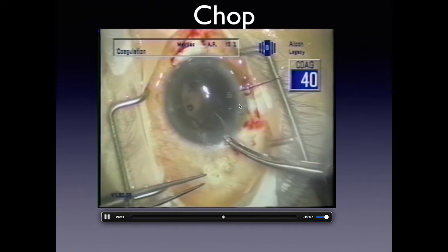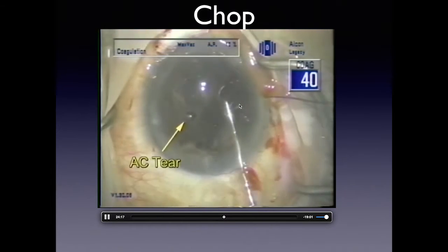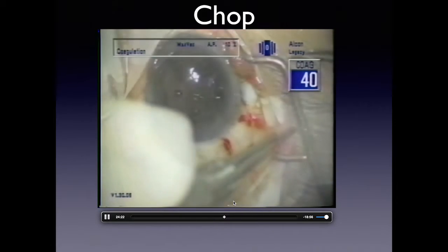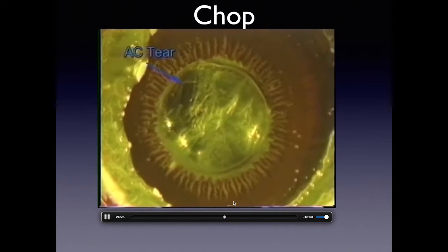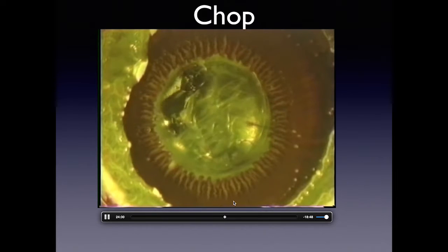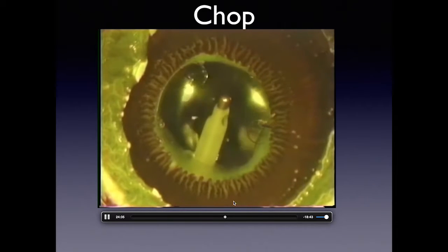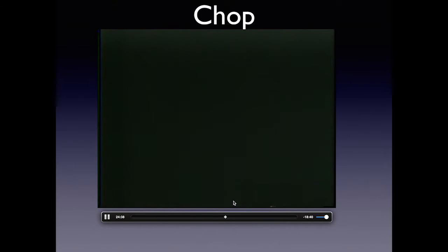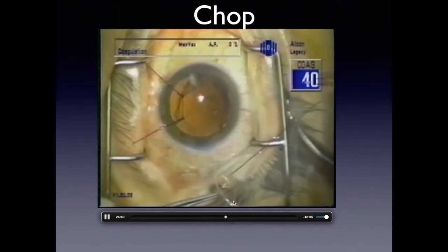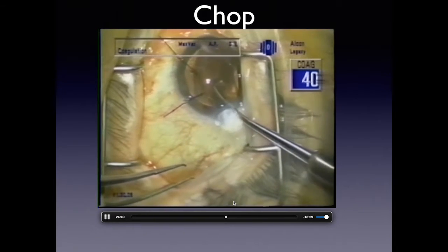There are about 31 minutes of video showing each of these different types of techniques — how to use them, including with an anterior capsular tear. The Miyake view is useful to understand where these devices sit in the capsular bag. Using a capsular tension segment requires understanding it provides holding capability in 120 degrees but doesn't open the full bag, so you almost always also use a full CTR — usually at least the 14-millimeter one unless the eye is very hyperopic, or a 12.5-millimeter ring for pediatric cases.